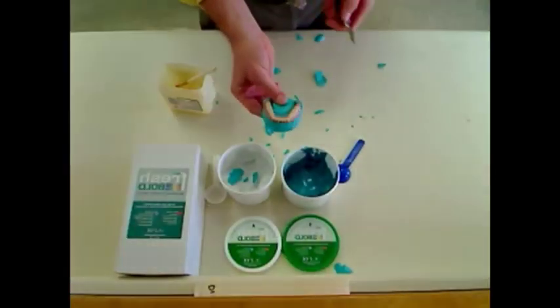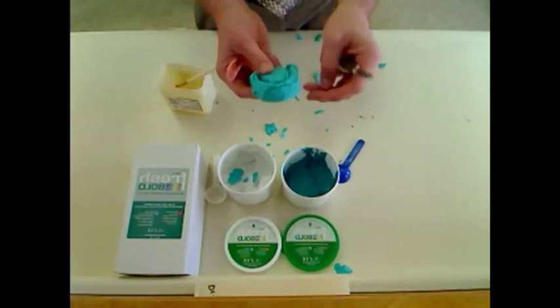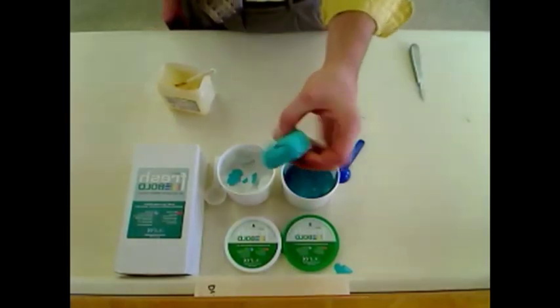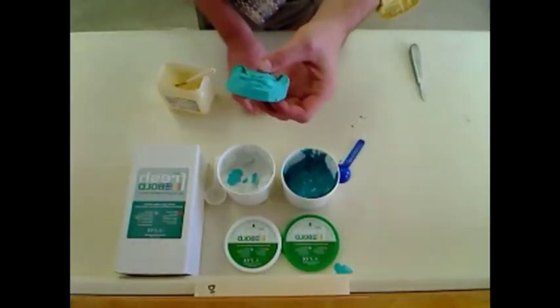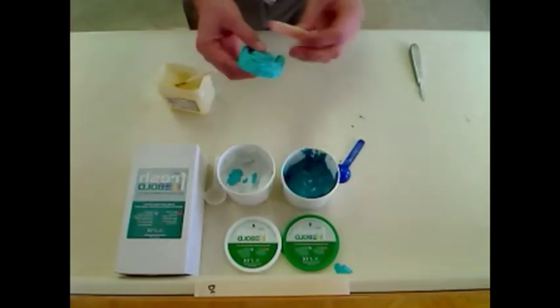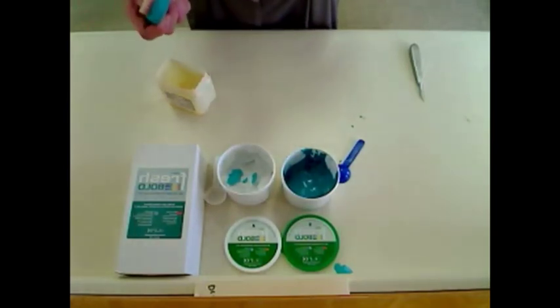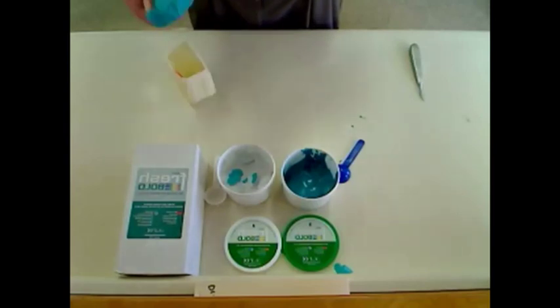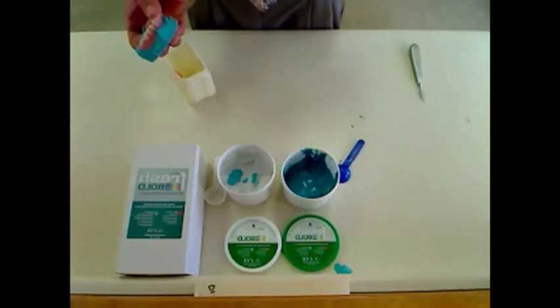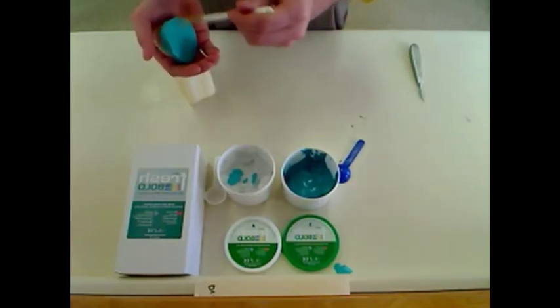Once you have that base trimmed, the denture should come right off. Once you trim the base from the denture, we now need to take basically an impression of the denture and the base. So we need to Vaseline the entire base and the denture. If you don't Vaseline the base and you put on more silicone putty that hasn't set yet, there will be a chemical reaction and they'll bond to one another. So you just want to make sure you get it really good.